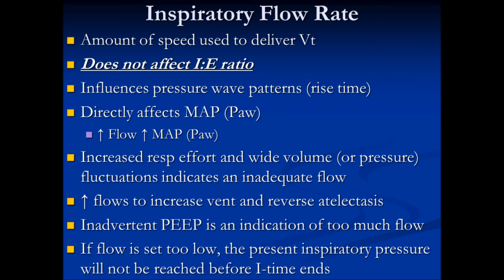Increase flows to increase your ventilation and reverse atelectasis. So we utilize flow to help ventilate the patient better and to pop those airways open, especially for neonates because their airway is so small. The more flow you have, the more you will overcome that airway resistance, and therefore they'll ventilate better. And because you've overcome that airway resistance, you'll be able to get more down into the alveoli and be able to pop it open.